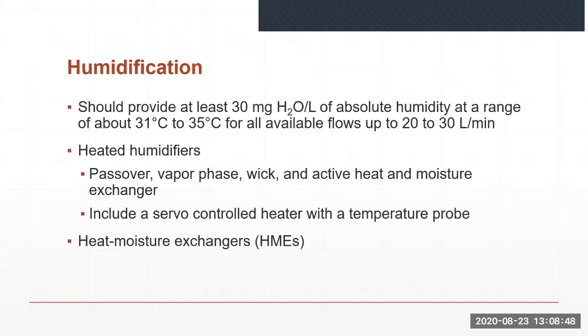Whenever the temperature in the patient circuit is less than the temperature of the gas leaving the humidifier, condensate accumulates in the circuit. Notice that condensate accumulation, or rainout, will increase as the temperature becomes cooler.